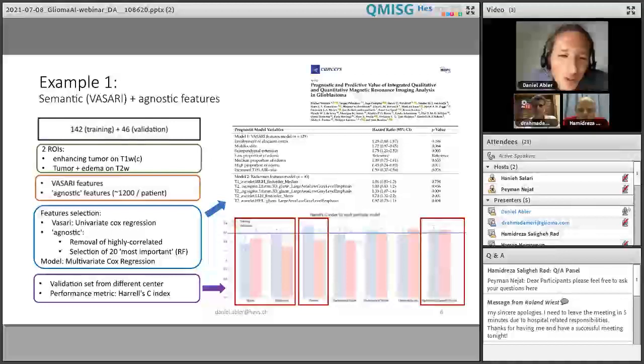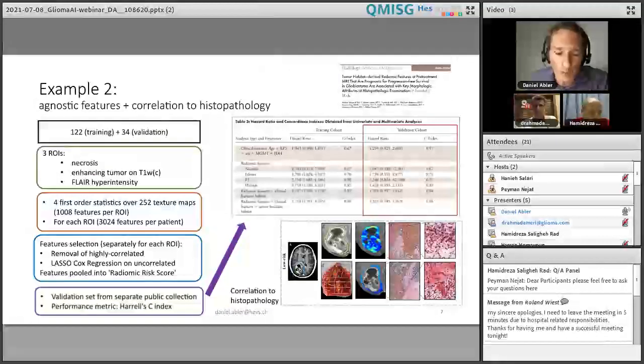And if you compare the performance of the clinical features alone with the imaging features alone, then the performance improves substantially at the very right when you combine all imaging and clinical features together, and also the model appears to become more robust. So here they included very well interpretable features in the model.